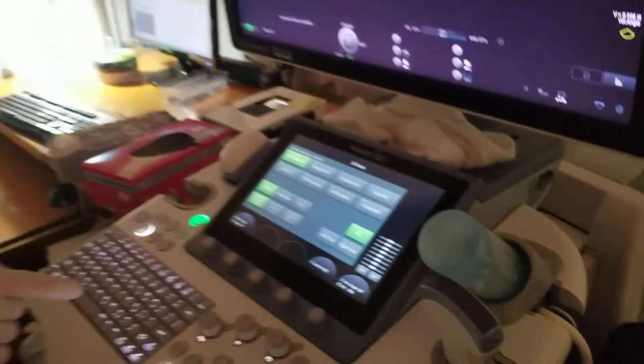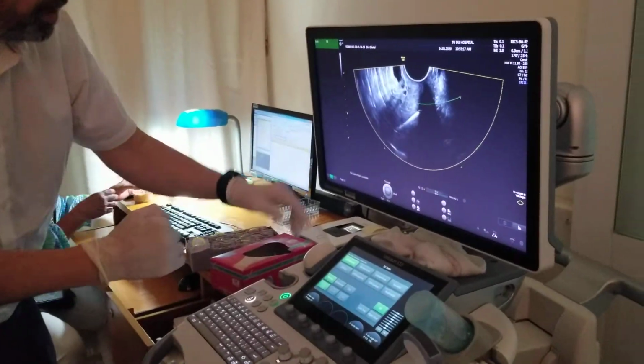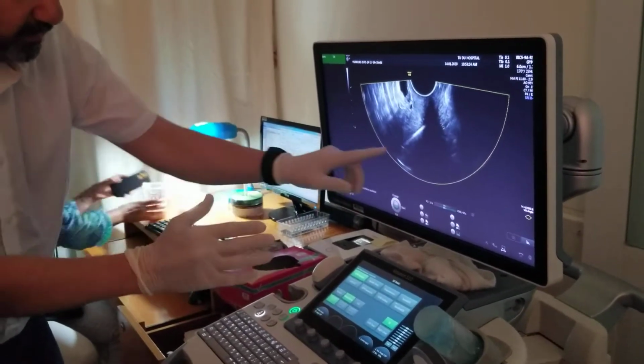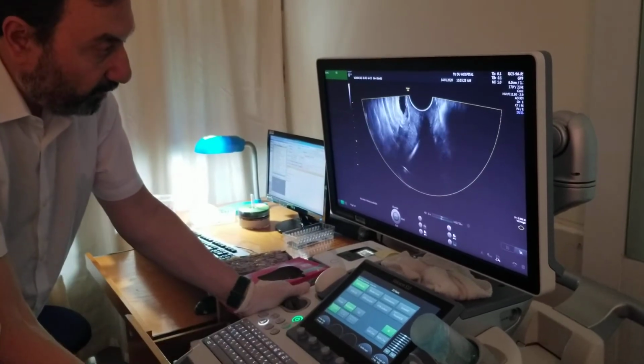And then you see this green line here? This will bring a 3D volume. But I'm gonna get 3D volume only without the 3D itself. I will show what that is. So go back to the mid-sagittal plane that we have.